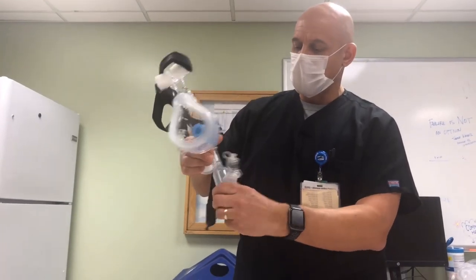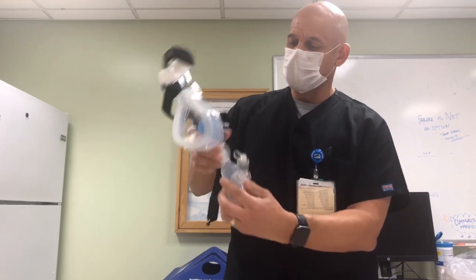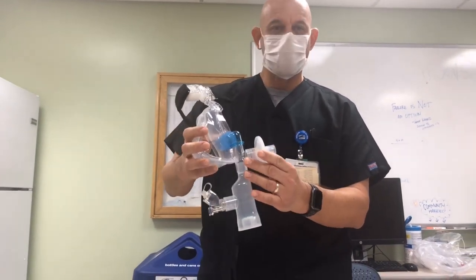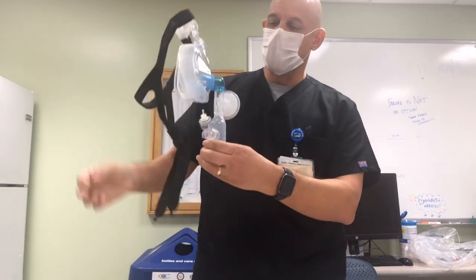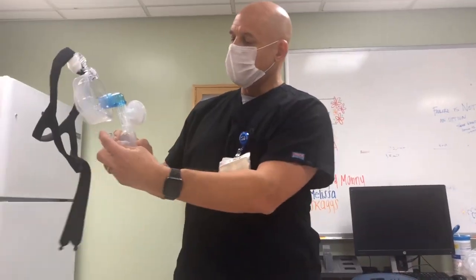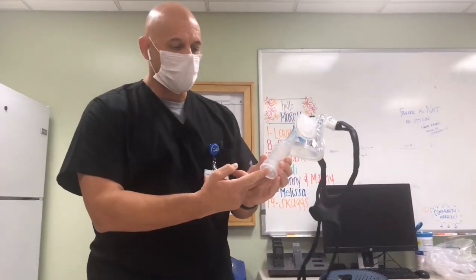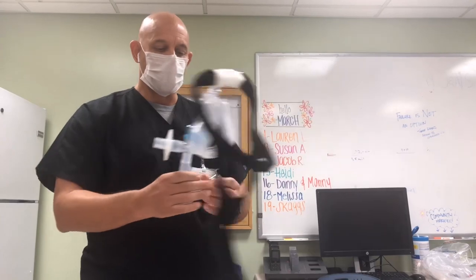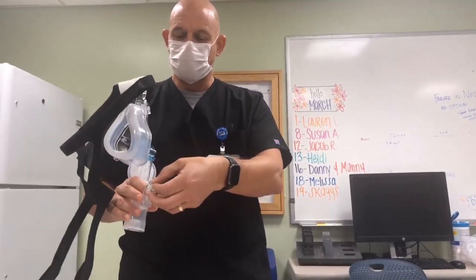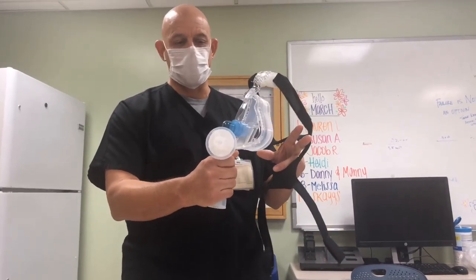We used a continuous Aerogen system connected to a T-piece, used a bacterial filter — 0.27 microns, 99.99% filtering. We'd hook up the oxygen at the bottom here, it would give enough flow. We'd put the treatment albuterol in the cup here, place it on the patient, and they'd be able to breathe while getting a continuous treatment.